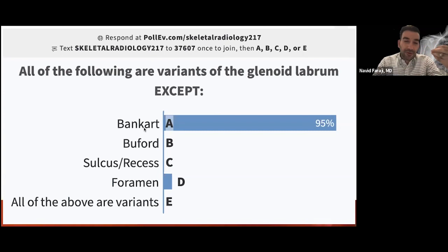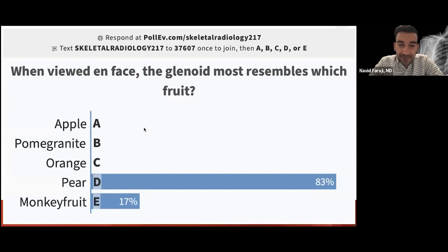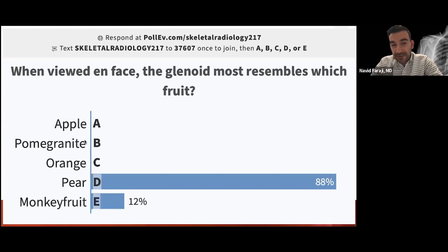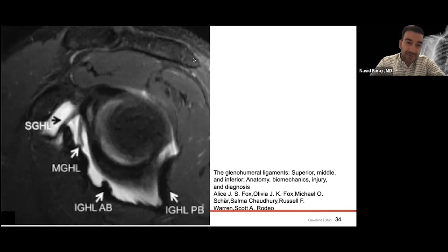Question: when viewed en face, the glenoid most resembles which fruit? The answer is a pear — the pear-shaped glenoid. The glenohumeral ligaments are critically important for passive stability. The inferior glenohumeral ligament inserts partially on the anteroinferior glenoid, so a labral tear in this region allows extra motion with the IGHL — an important cause of instability, especially with passive range of motion. The rotator cuff is more important for dynamic stability.